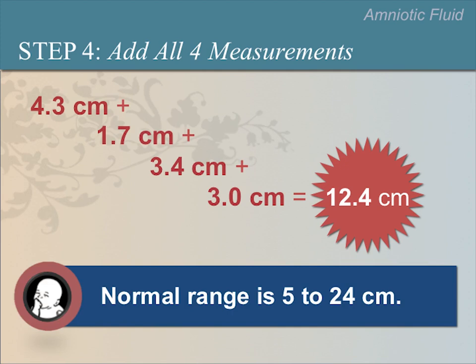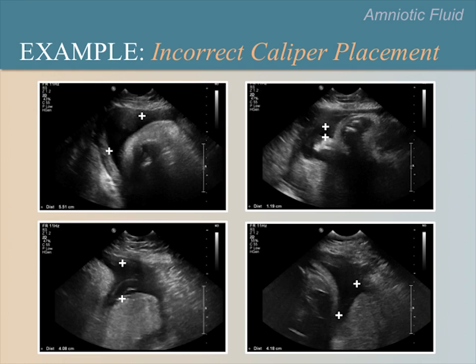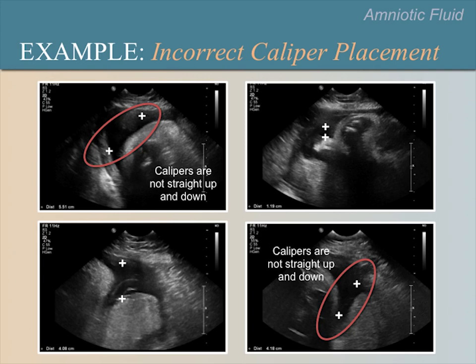Here are several examples of incorrect caliper placements to measure the size of the amniotic fluid pockets. Please pause the video now to ask participants why these caliper placements are incorrect. In the upper-left and lower-right images, the calipers are not straight up and down from each other. In the lower-left image, there is umbilical cord in the vertical path connecting the two calipers. In the upper-right image, the top caliper was placed too low, which means the measurement for this pocket is smaller than it should be.